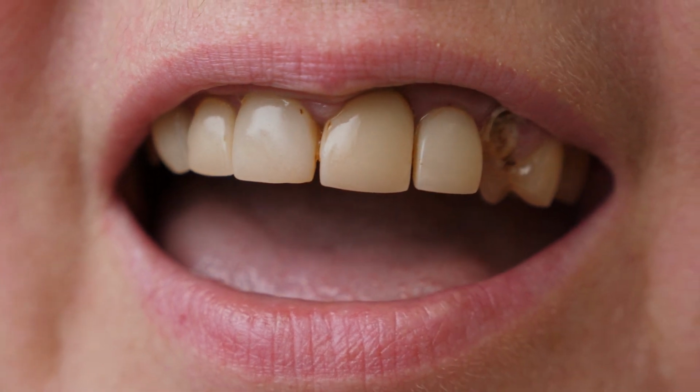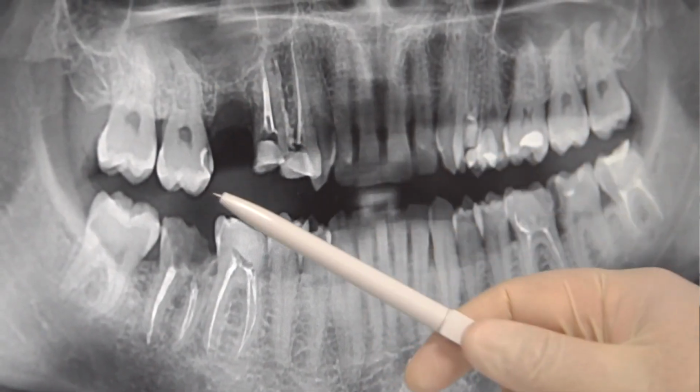But let's talk about the actual workflow from a digital dentistry and laboratory standpoint. This is an example: you come in, you've broken a tooth off, and we're going to place an implant. And we need to now find a way to put a tooth in. Let's say it's a front tooth, right? That's the one you don't want to walk around with nothing. Of course, it does vary from patient to patient depending on your bite and other factors. But using the digital dentistry and in-house lab workflow, we can go ahead and scan your mouth.